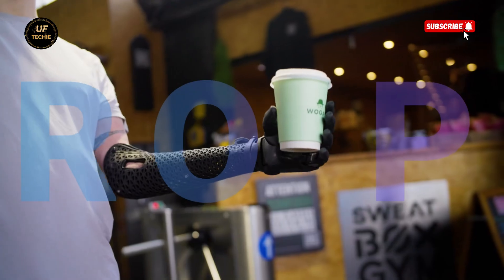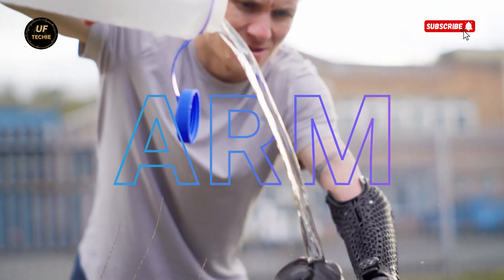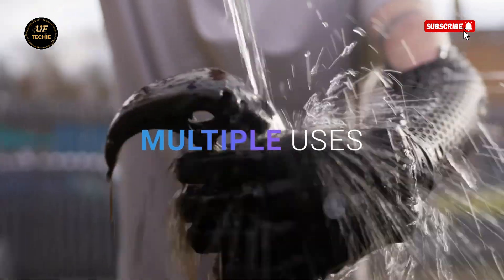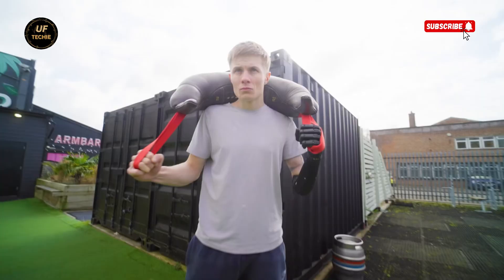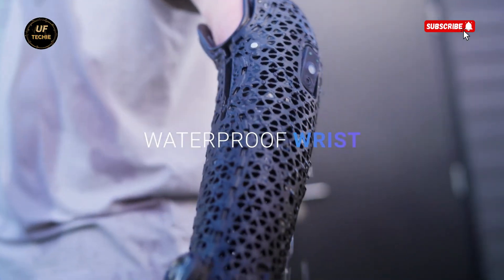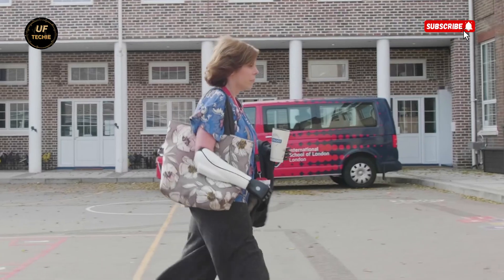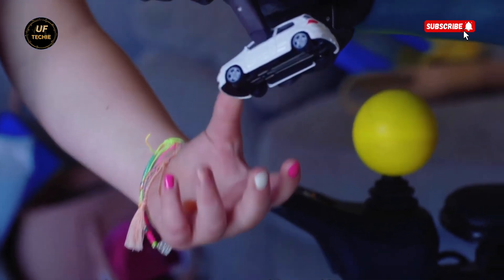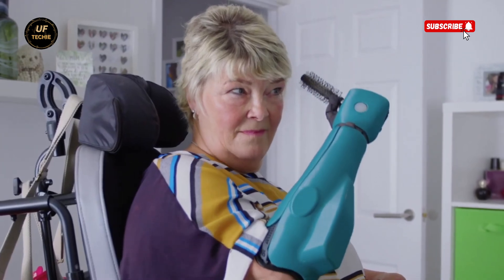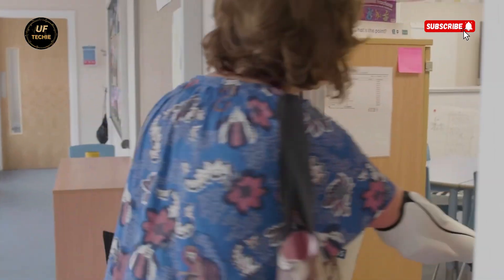Open Bionics has redefined what a prosthetic can be. By using 3D printing and modular design, they've dramatically reduced the cost and time it takes to make a prosthetic. What once took months or even years to create can now be made in a matter of weeks. And because it's made from modern, durable materials, maintenance is simpler and more affordable than traditional prosthetics. This isn't just about replacing a limb — it's about redefining what's possible.